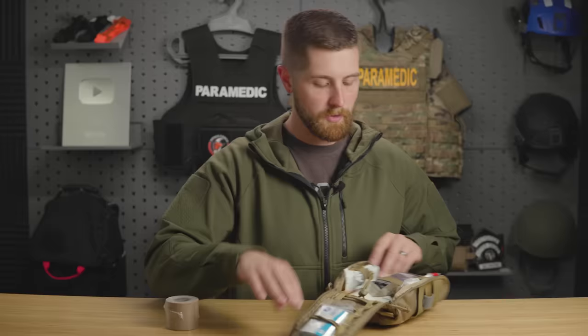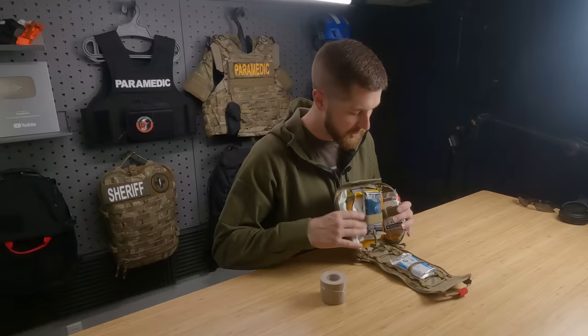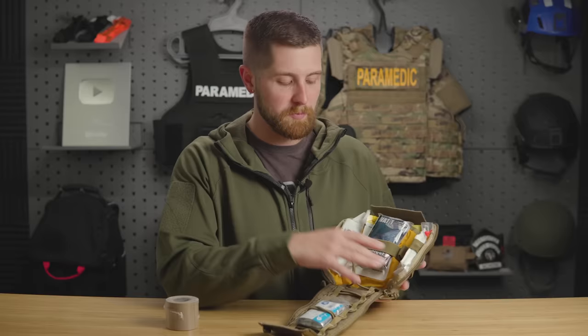Now into the pack, what you have on the inside here is this orange backing. And I really like having a backing that's not the same color as the kit, not this brown or black, gray, just because that allows you to see your equipment a little bit more clearly. Now, obviously if you're in a super secretive location, or you're taking enemy fire or something, yeah, a bright color might alert your enemies, but that's not a realistic threat or fear in most cases. Nothing that I've done, at least. So I wouldn't worry about it. I like just being able to see my equipment.